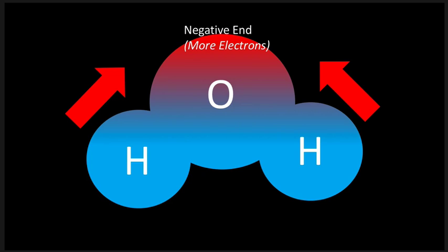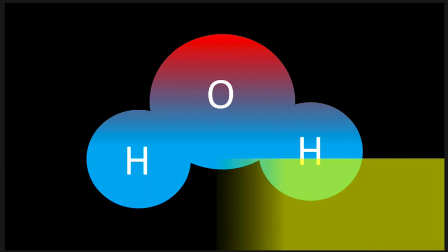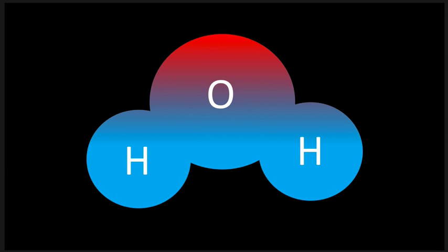The pull on the hydrogen electrons, I guess there's a couple ways to think about it. One would be to think about it like a top that's uneven, spinning, how easy it would be to spin, that kind of thing. Another way to think about it is that when it pulls the electrons towards it, it's exposing the hydrogen nuclei. So when they get hit with a pulse, it really spins them.